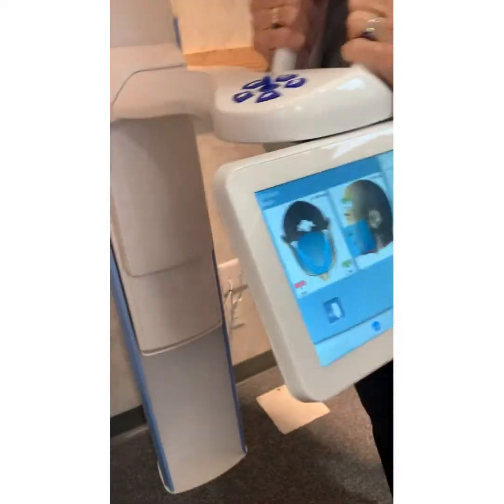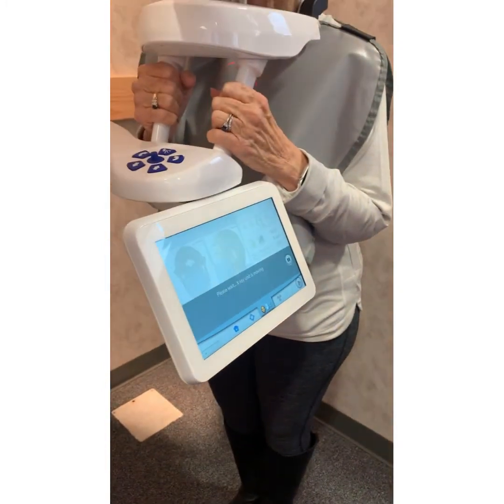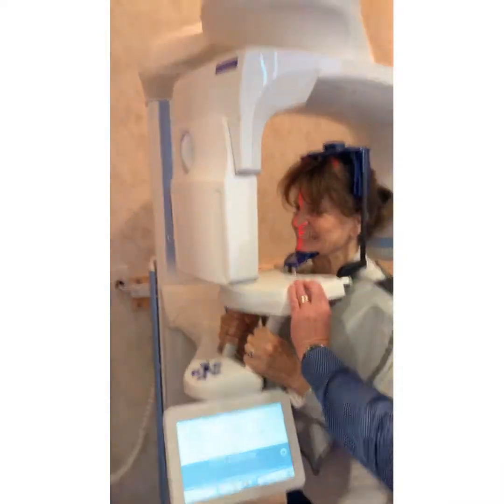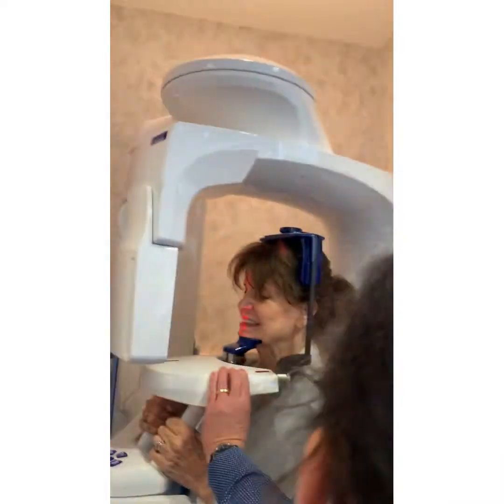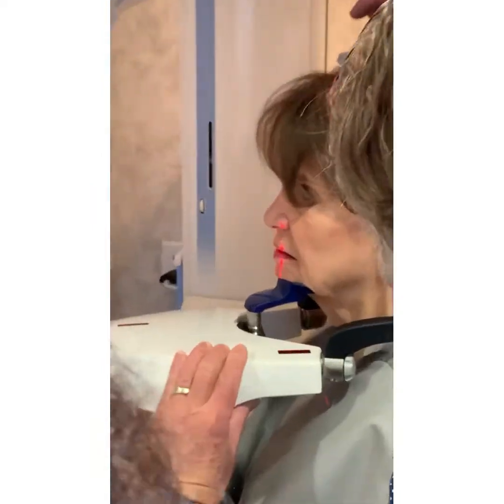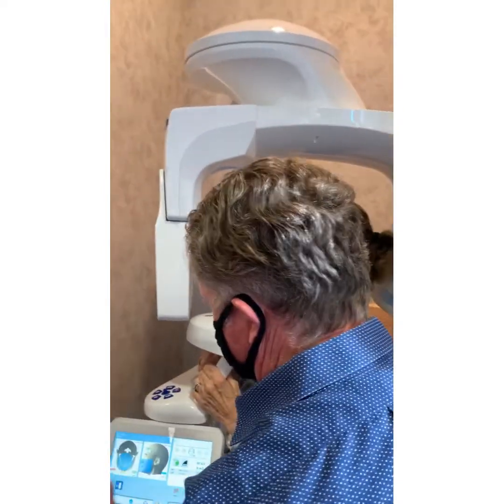As you were before. This is where you're going to hit your little 90-degree button. So bring this out of the way. Smile for me, please. Like the teeth. Okay. See where that is? That's right in front of her. Now she can relax. That's a funny toe right there. That's going to be okay. Don't worry, that stops when it feels resistance. At least it's supposed to.